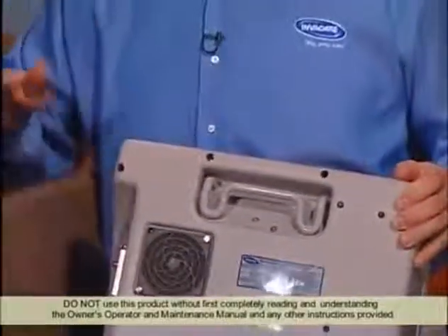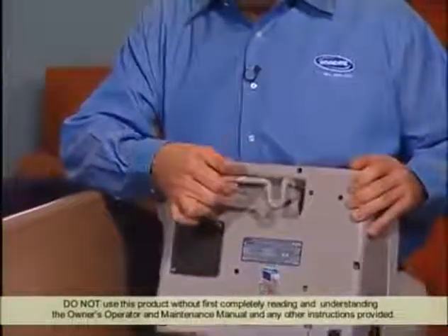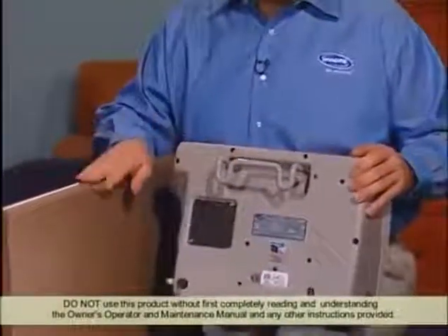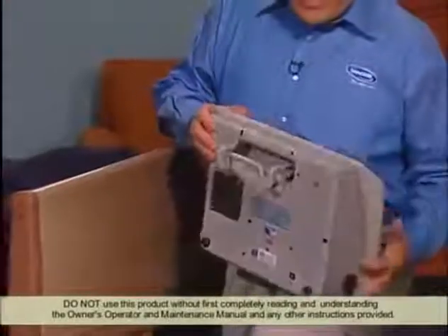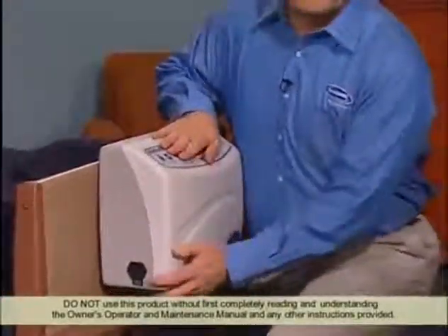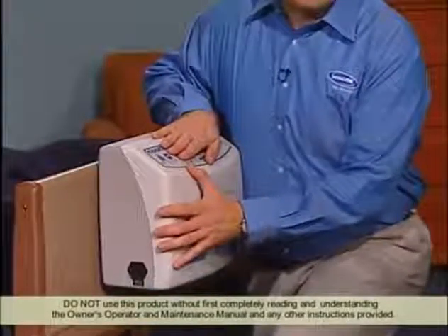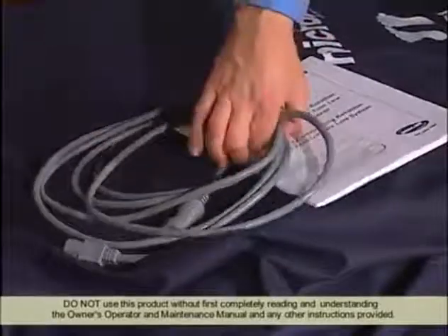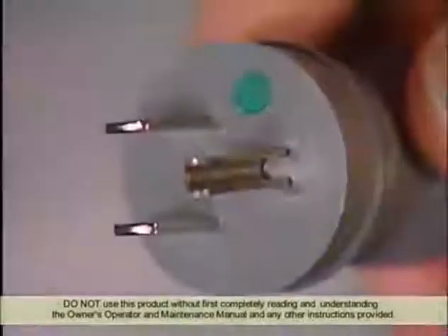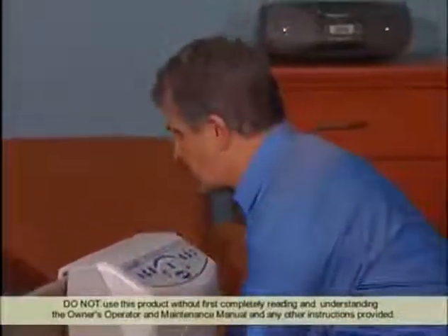The power unit will hang on the bed end. It has an adjustable mounting bracket on the back. Slide it out to adjust for the depth of the bed end and simply hang it on the end and cinch it up. And that securely mounts it to the bed. Once the unit is securely mounted to the bed, plug it in. And we have a 14-foot power cord that's hospital grade and grounded. Plug it in here and run it over to the wall receptacle and plug it in.